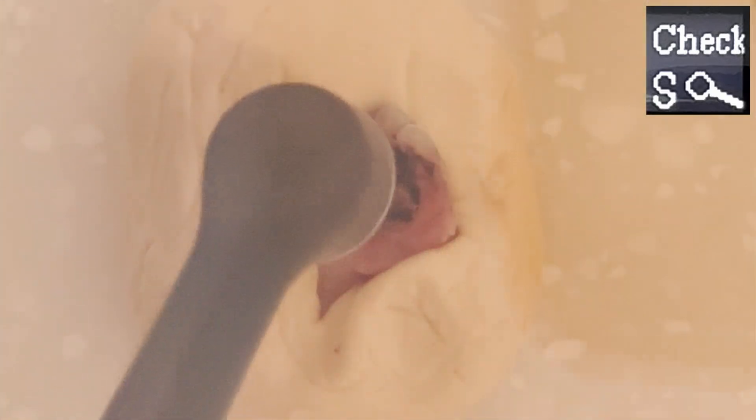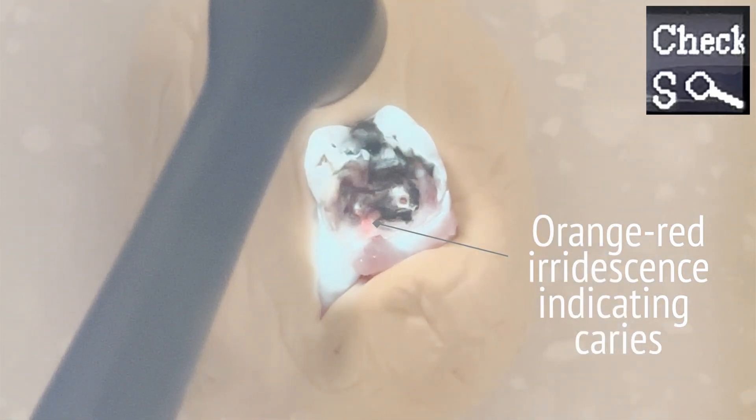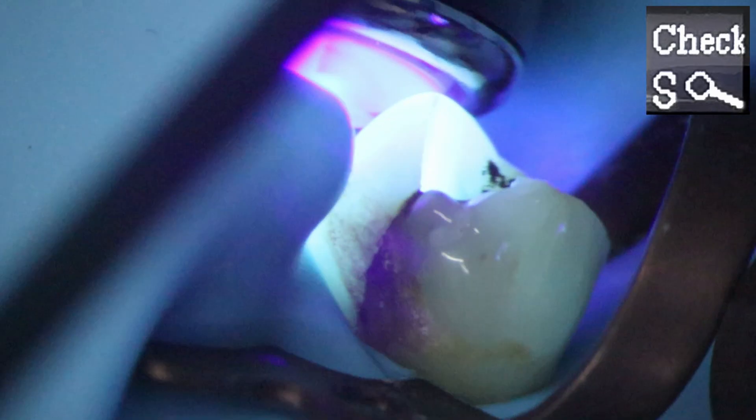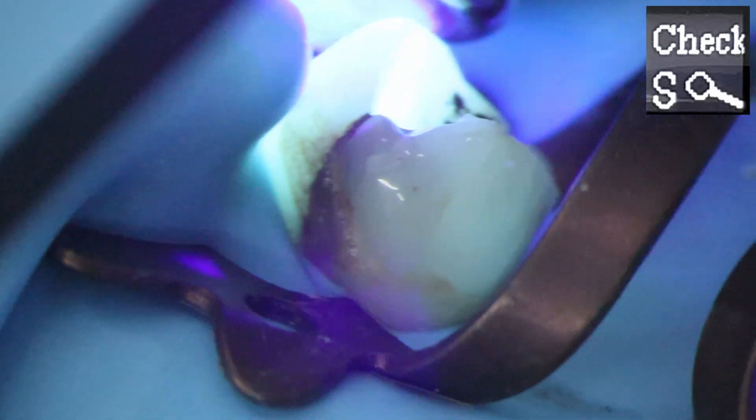Getting good footage of the decay detection is proving very difficult — the footage does not do this mode justice. In real life, decay tends to show a very distinct and obvious iridescence that simply doesn't capture well on photographic equipment. Another more unofficial use is as a crack detector, and it works really well. This is mainly because the light intensity in this mode is vastly reduced, allowing direct vision on the tooth whilst testing for cracks.